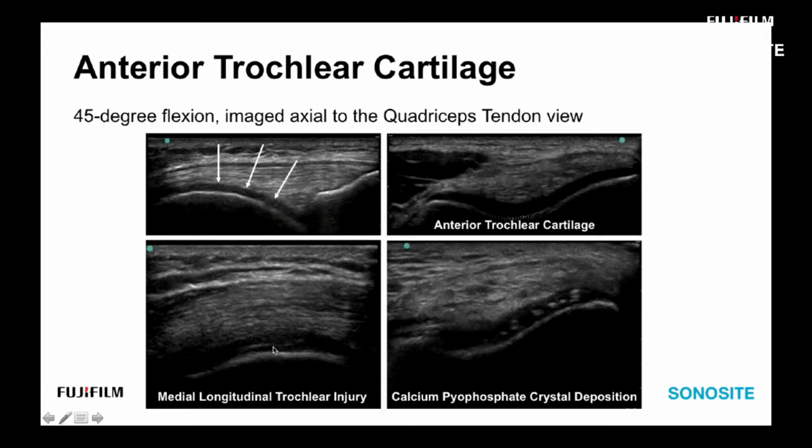But this was actually an injury, a contusion of somebody coming down on their knee and probably delaminated some sort of cartilage interface there. Here we have CPPD, the calcium pyrophosphate crystal deposition, all within the cartilage. Okay, so it's not coating the exterior part of the cartilage; it's on the internal part of the cartilage. So this would be more of a pseudogout versus actual gout.